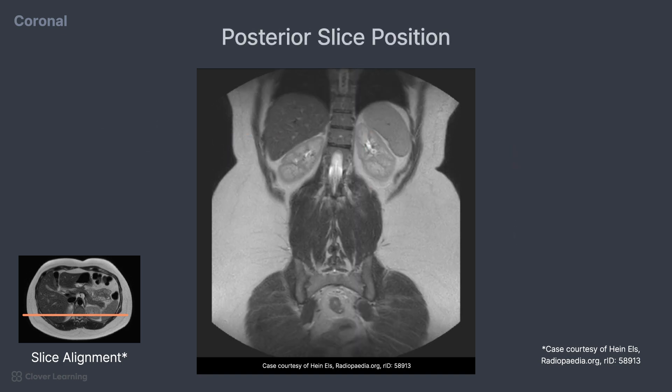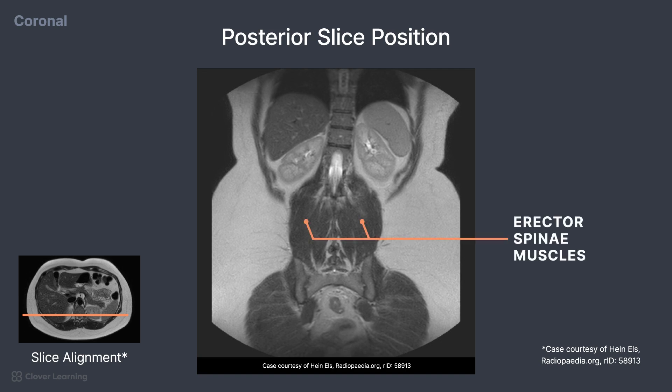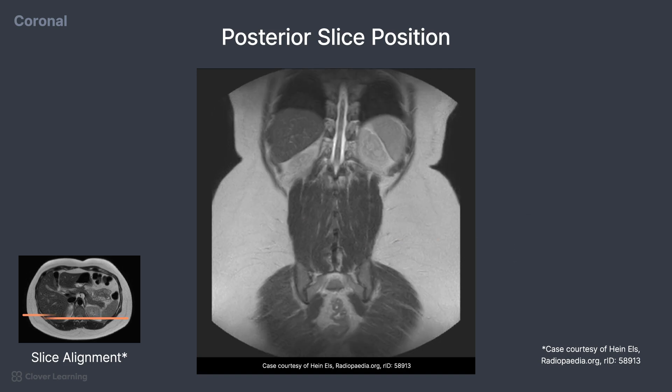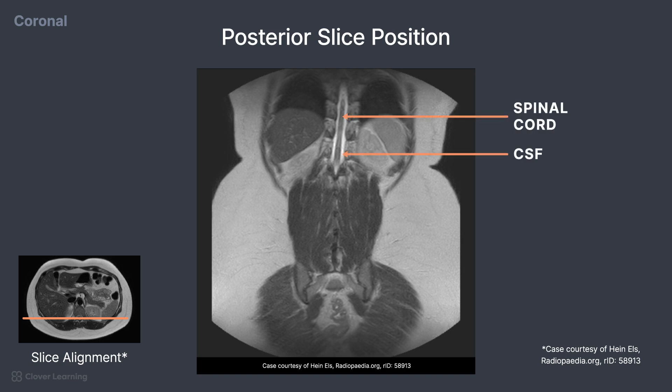As the slices continue posteriorly, the structures of the abdomen begin to reduce in size, and the erector spinae muscles begin to emerge. A portion of the spinal cord in the thoracic area along with the CSF is now visible.